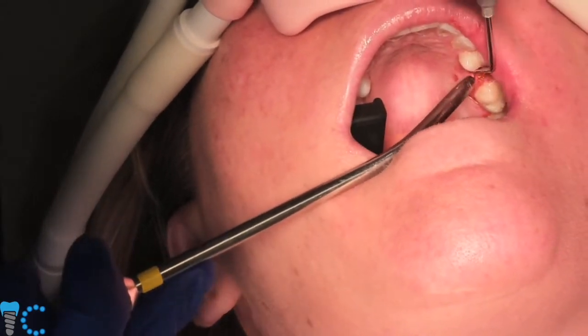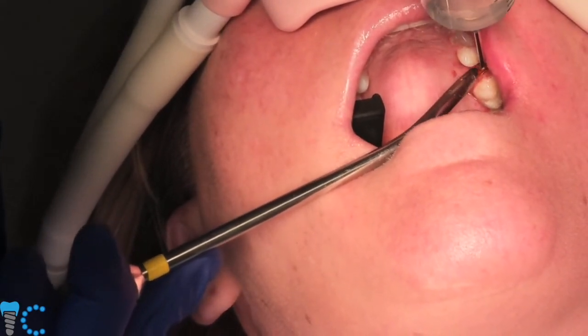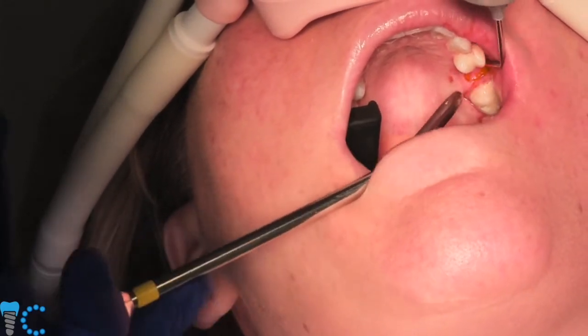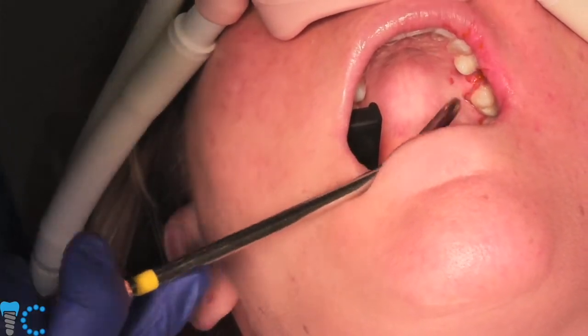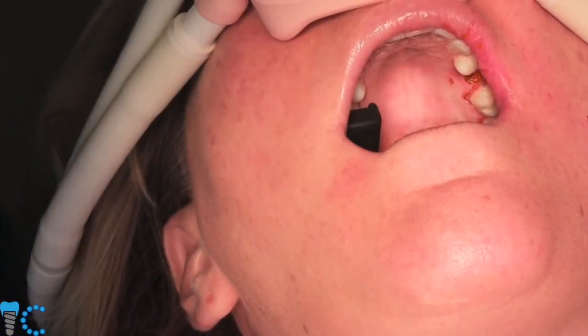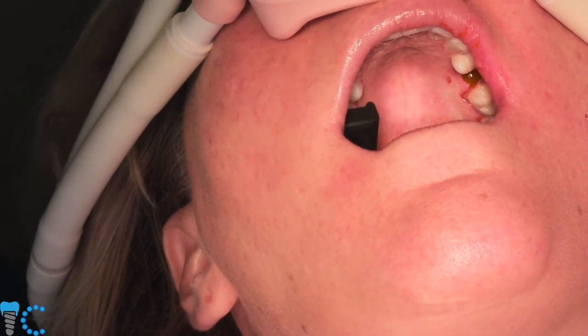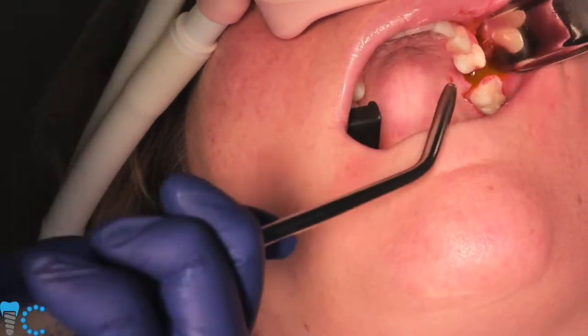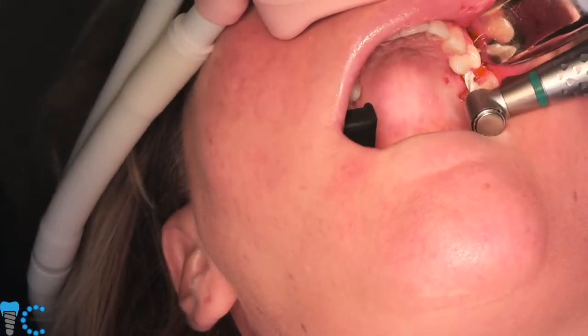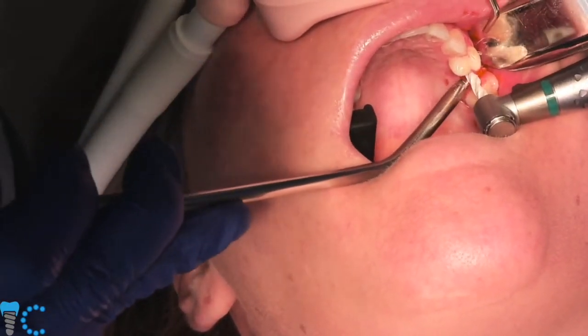No, yeah, we set it to 800 RPMs. Anything between 800 and 1200 is probably fine. And the nice thing, these are all ceramic drills as well. These all-ceramic drills are very sharp and they stay sharp. So, how do you find the lifespan of the drills is a lot longer than a titanium drill?